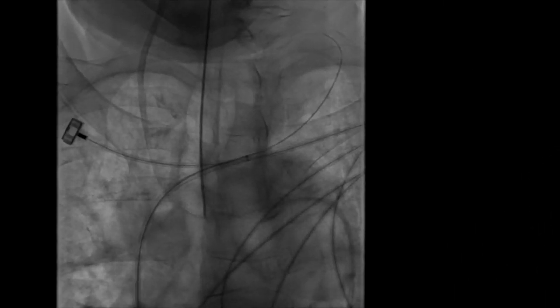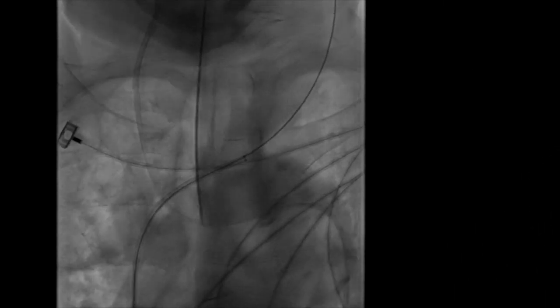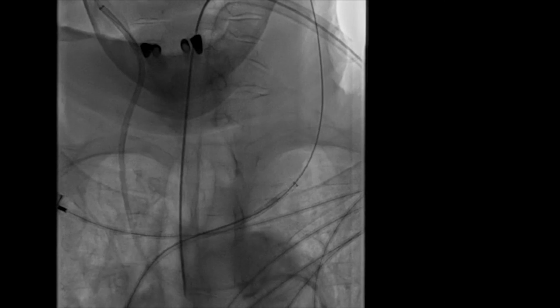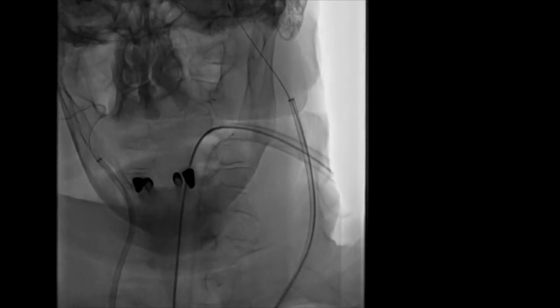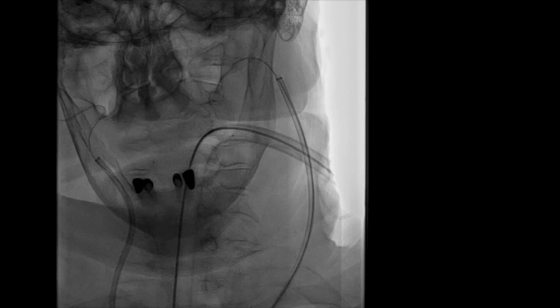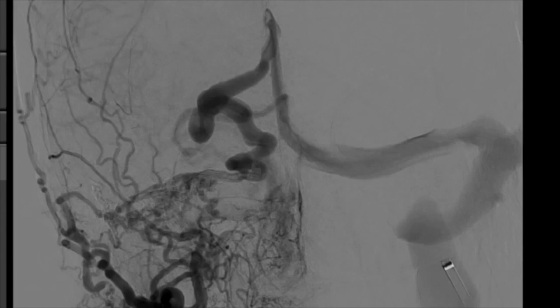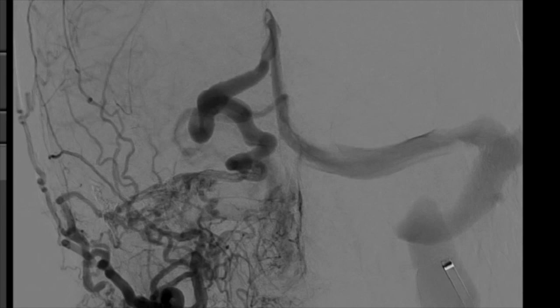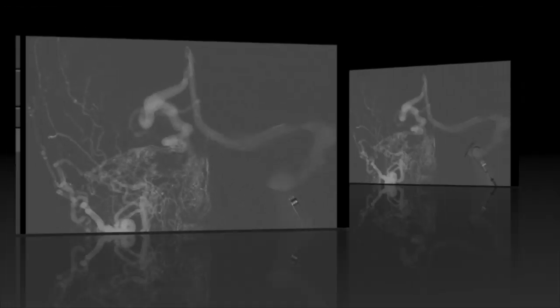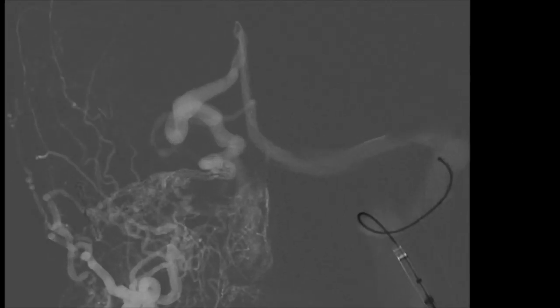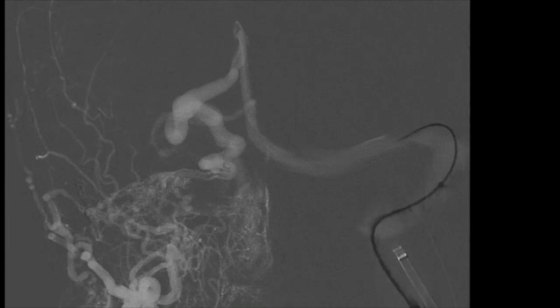A Neuromax guide catheter is advanced into the internal jugular vein. You can observe here the two catheters — one on the arterial side and one on the venous side. We further advanced the Neuromax into the sigmoid sinus and, on the roadmap, advanced the glidewire and the intermediate catheter for more support.